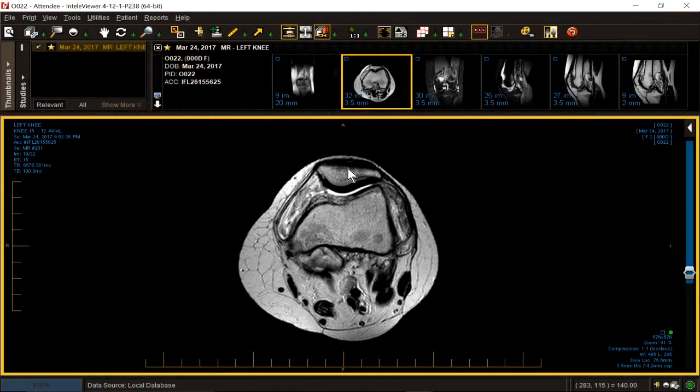Patient referred for a moderate, sharp, dull left knee pain for 2 weeks. Swelling, instability, locking from sitting to standing. Complains of knee pain, stiffness. It's a woman. She is born in 1994. She's 23.